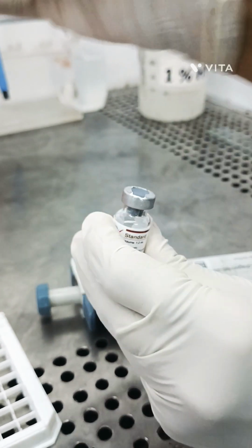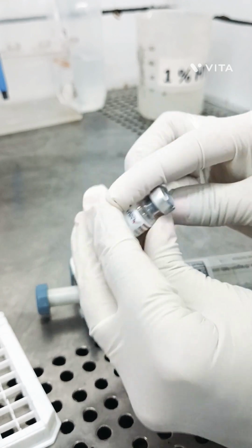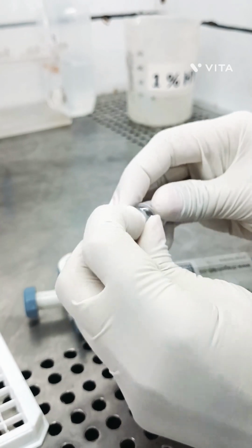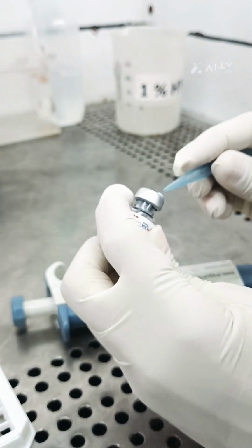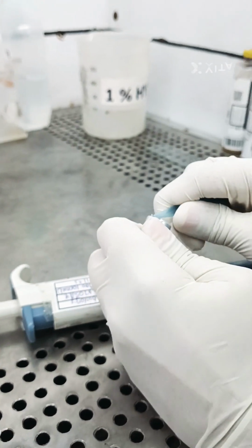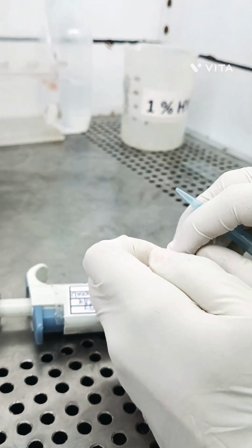For this standard, add 1.2 ml of deionized water and reconstitute it. Add distilled or deionized water into the ampule according to the volume indicated on the label of the ampule, and reconstitute the freeze-dried standard after 2 to 3 minutes.